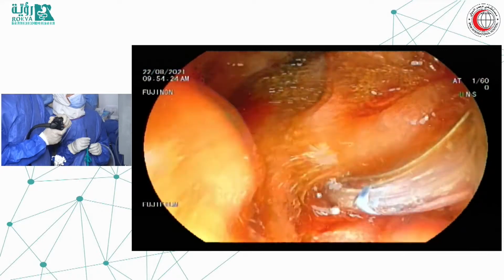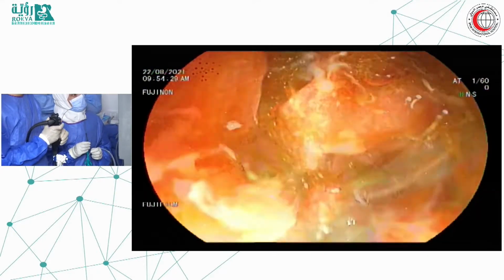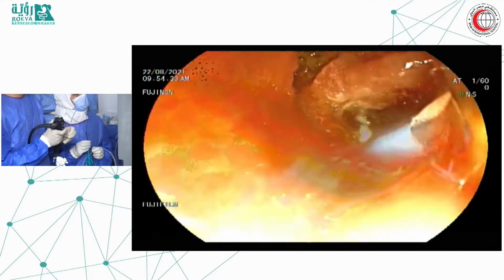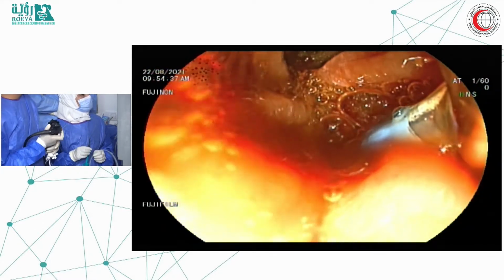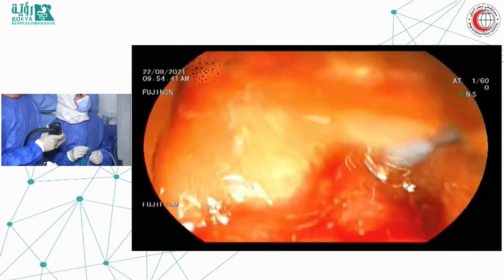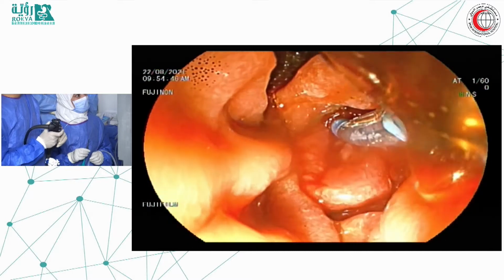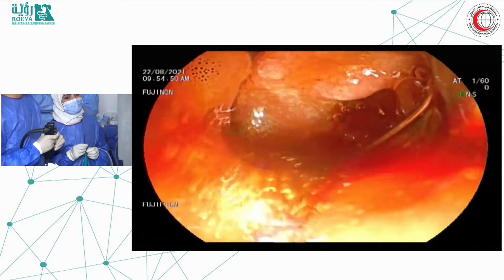This is our idea. Yeah, but if it is benign, you have an alternative that may be even more effective. On the other hand, I agree with you that if it is malignant, RFA is extremely safe. So I guess that with cholangioscopy and the biopsy, you can have an answer.